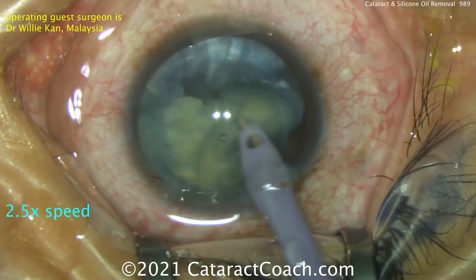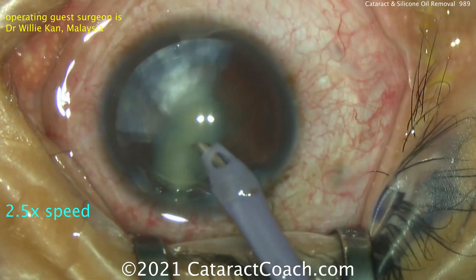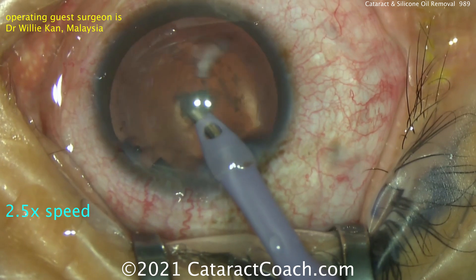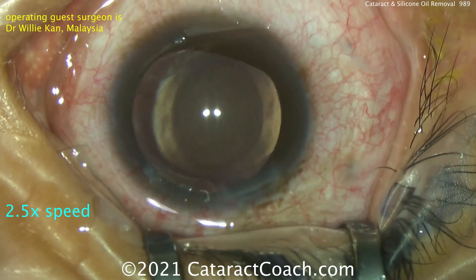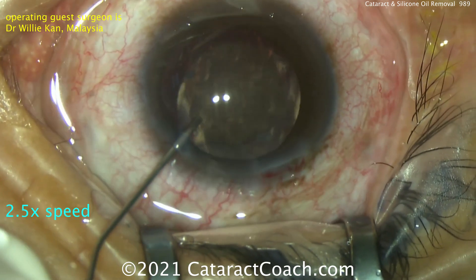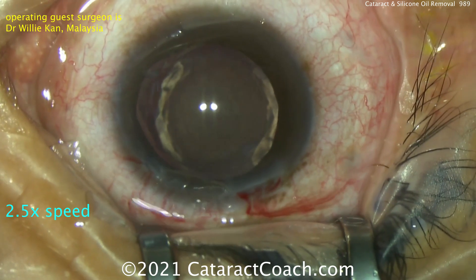Now if you're doing this part and you see silicon oil coming up into the anterior chamber, that can mean there's either a capsule violation or, more commonly, some weakness in the zonular support, and you can have silicon oil go up through that. The nucleus is removed very easily — that looks great. You can see there's a lot of silicon oil and a lot of pressure, so more viscoelastic is being placed inside the eye. Look at that big silicon oil fill in the vitreous cavity.